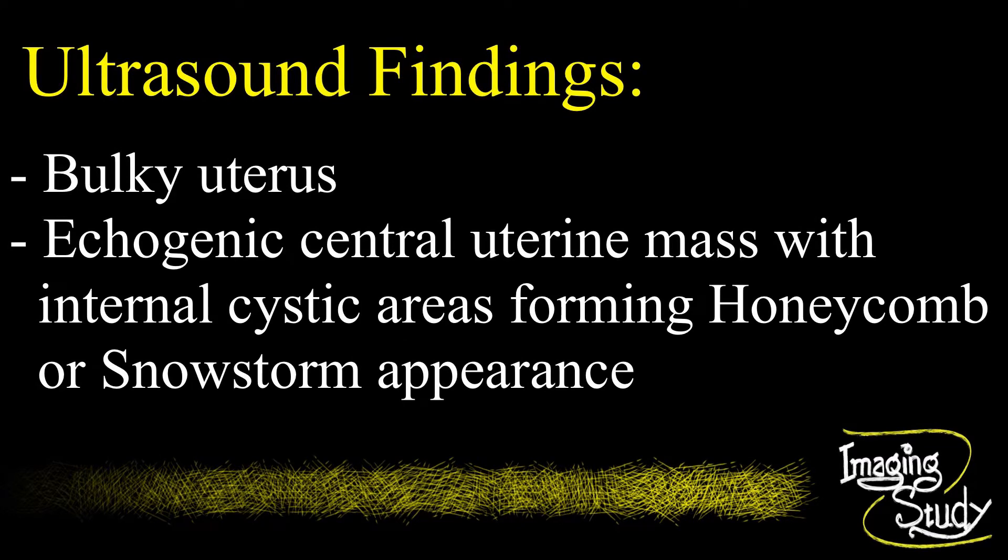On ultrasound, the uterus appears bulky. The center of the uterus shows an echogenic mass-like area with internal diffuse cystic change, forming a honeycomb or snowstorm appearance, which is typical for molar pregnancy.